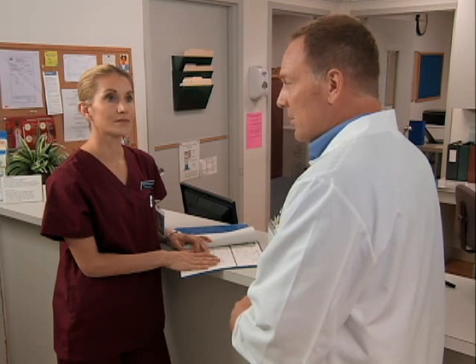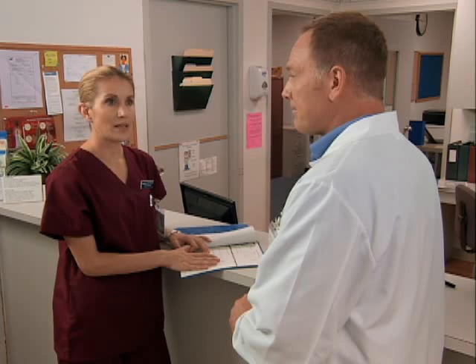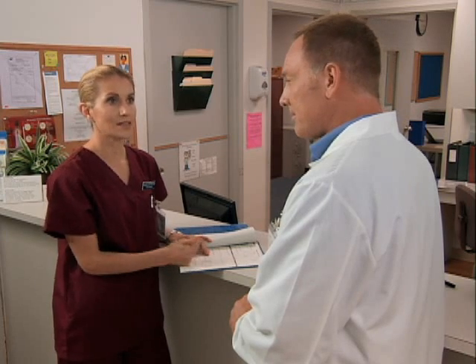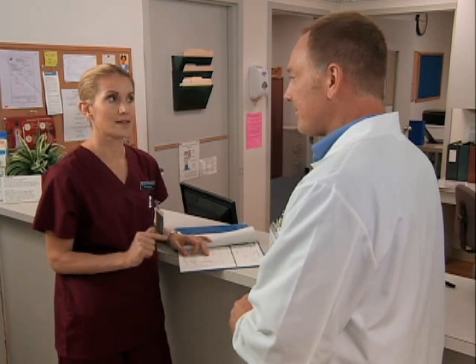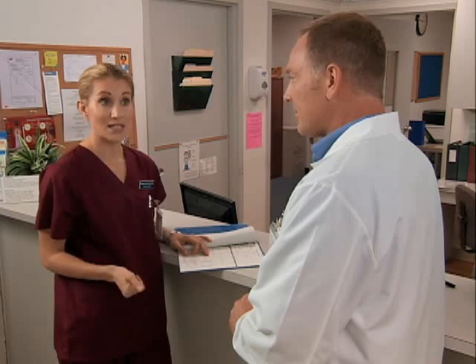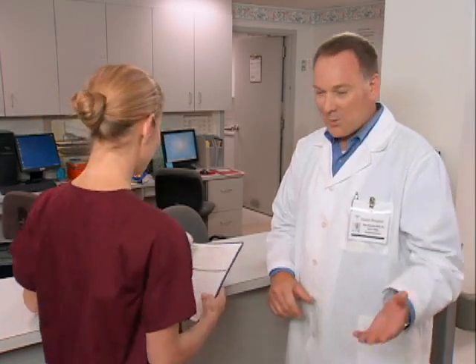Okay, now, one thing you'll need to do before you start is to gather your supplies. So what emergency equipment should already be accessible at the bedside? That would be a bag valve mask, oxygen, the obturator from the current tracheostomy, a spare tracheostomy of the same size, plus a spare tracheostomy one size smaller? Right, and suction equipment. Right. Okay, I think I'm ready. Let's get the supplies and go see my patient. Lead the way.